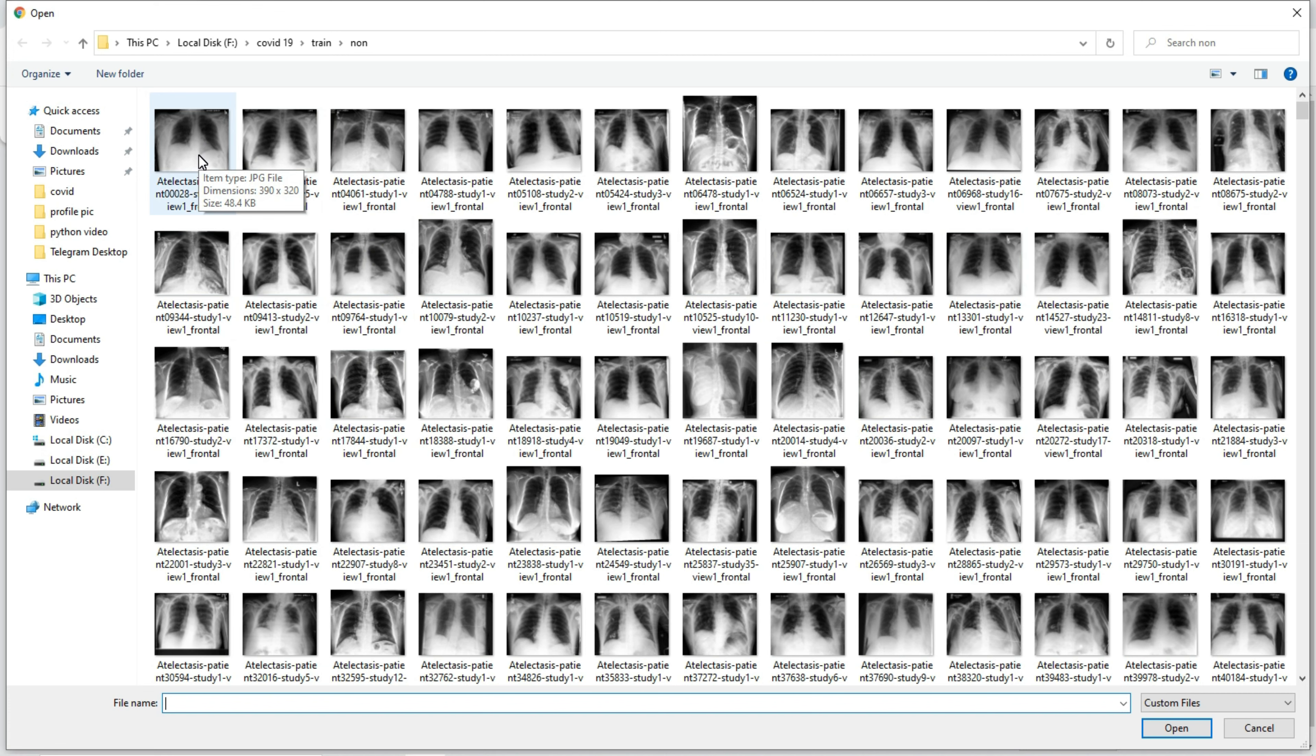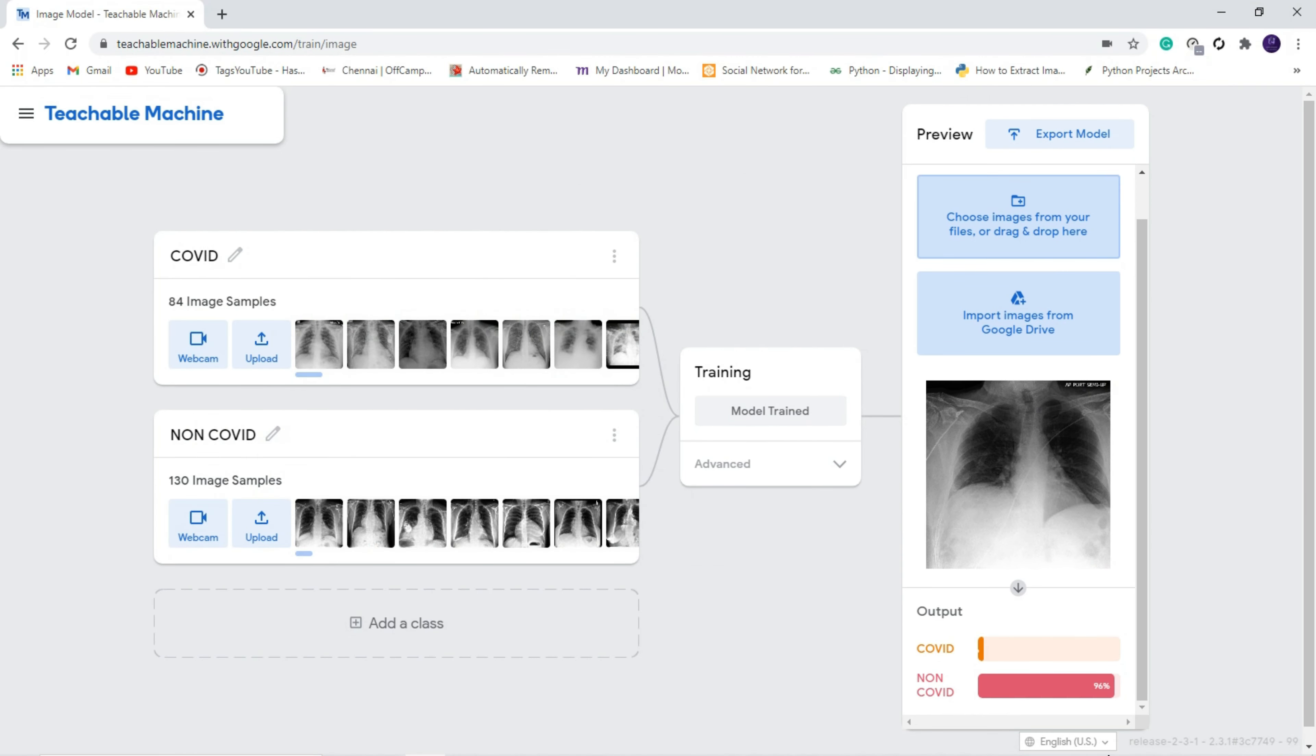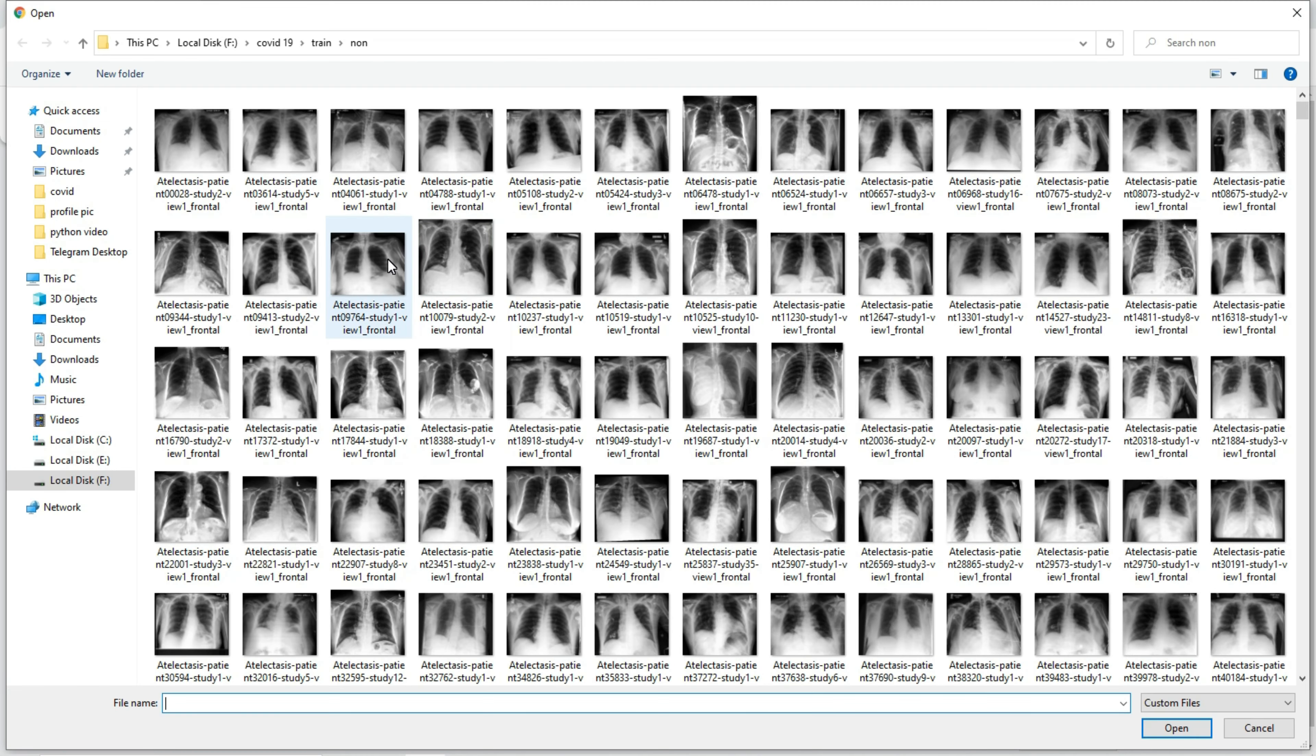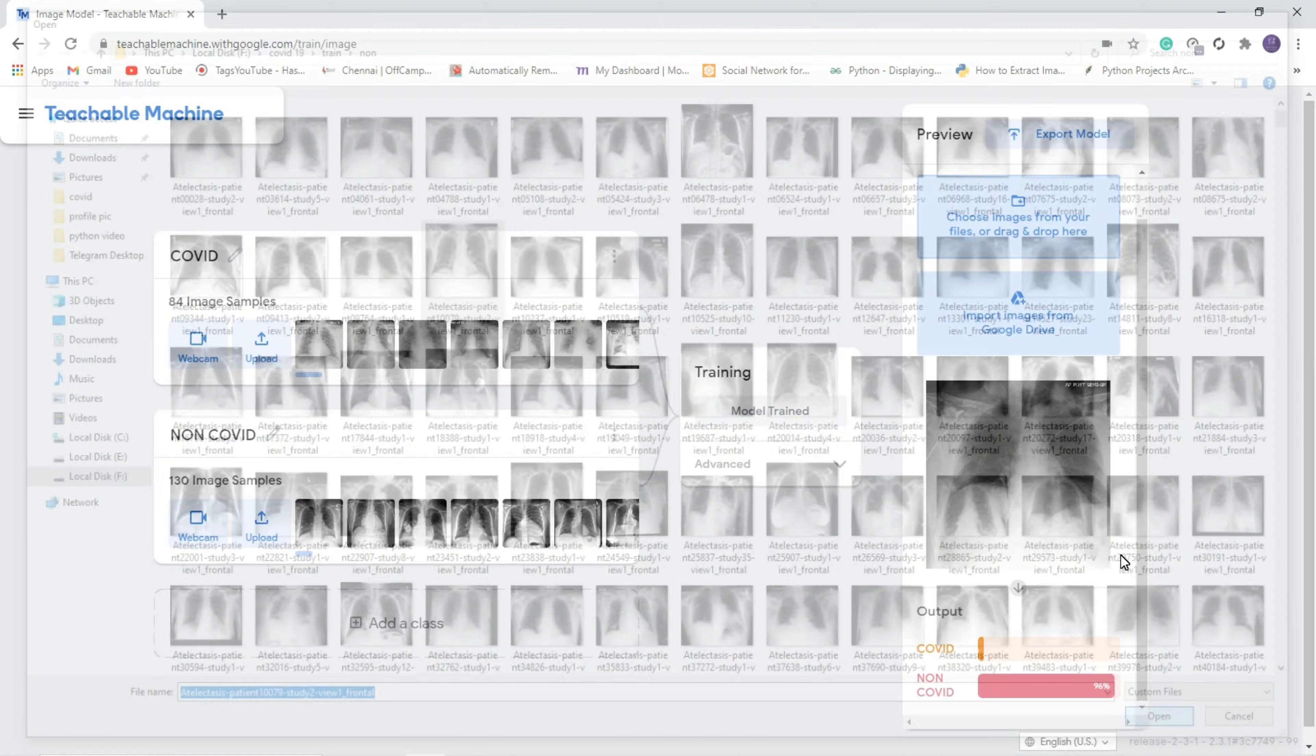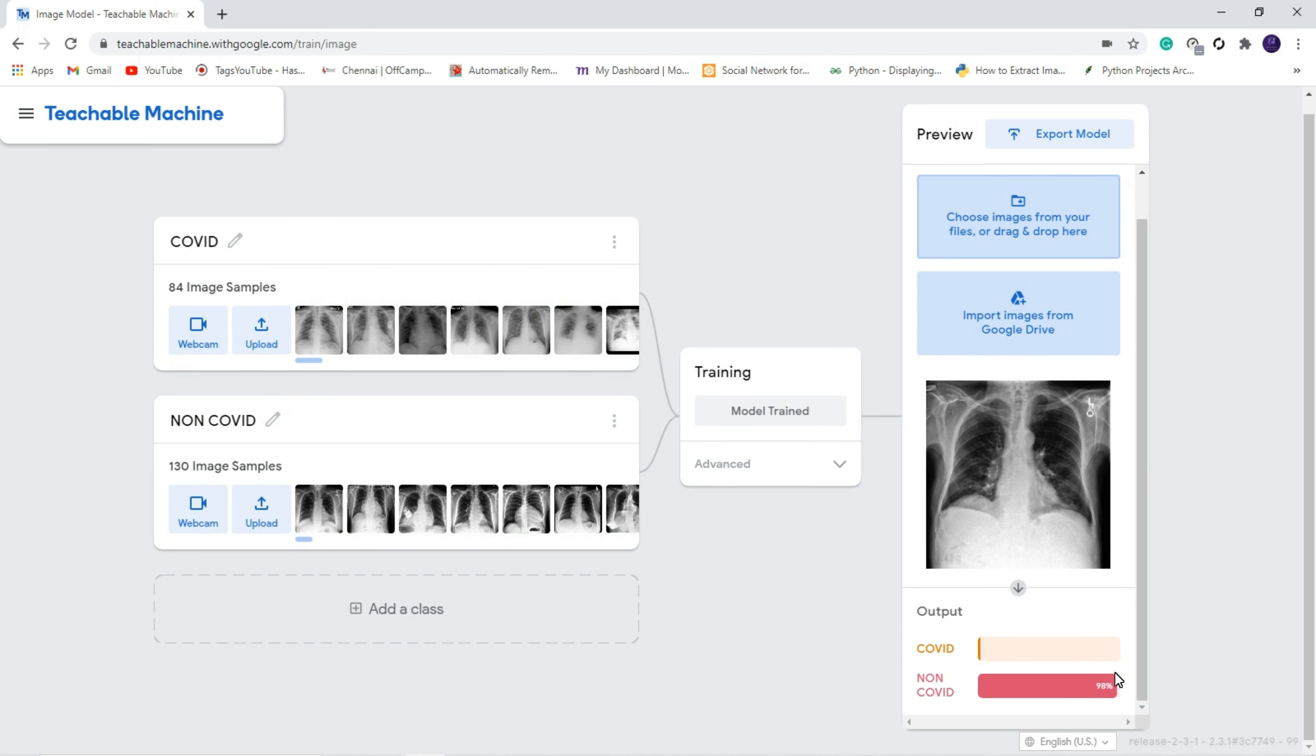If I am uploading this image, it has to show the image is non-COVID. Let us check it. You can see 96 percent the image has not COVID, and we will test more data. Again, 2 percent COVID and 98 percent not COVID. This is an X-ray image for non-COVID patient.